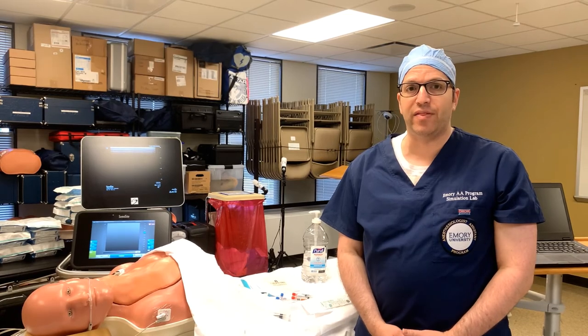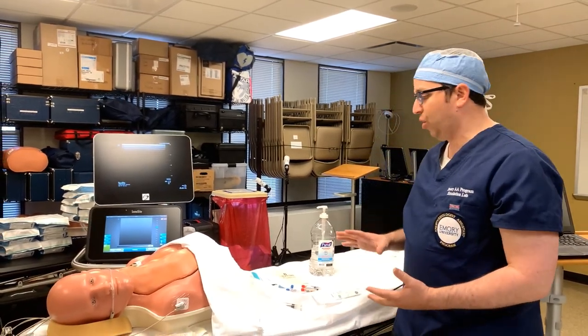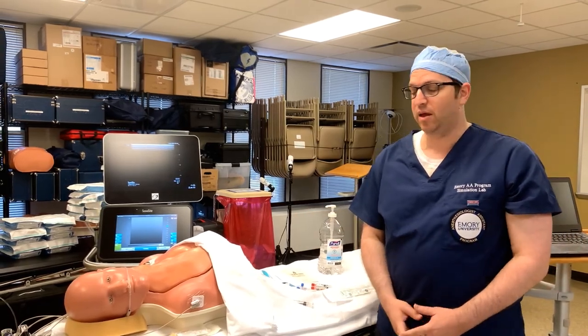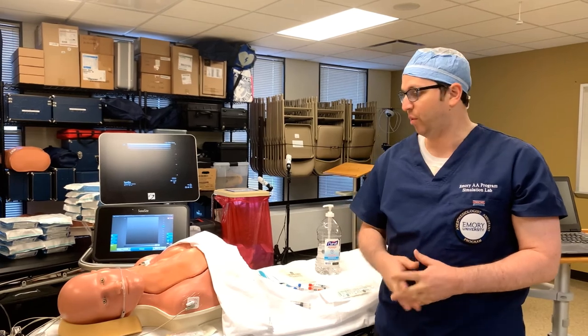Today we're going to be demonstrating ultrasound-guided peripheral nerve block placement on both the upper and the lower extremity. In just a moment I'm going to go through the equipment and the things that you need prepared and ready so that you have everything on hand for when you start the procedure.